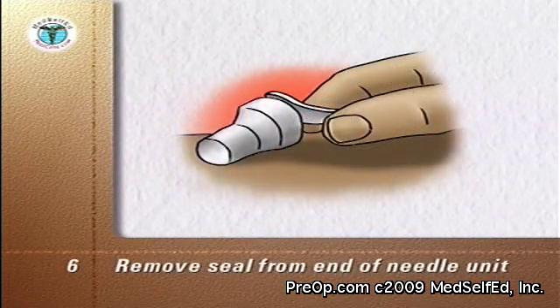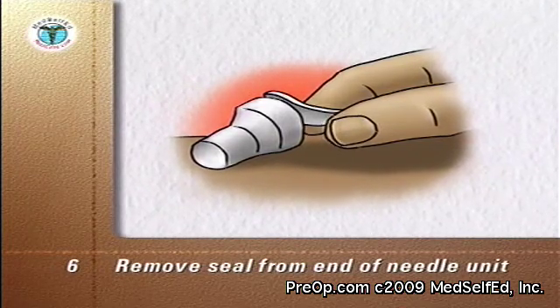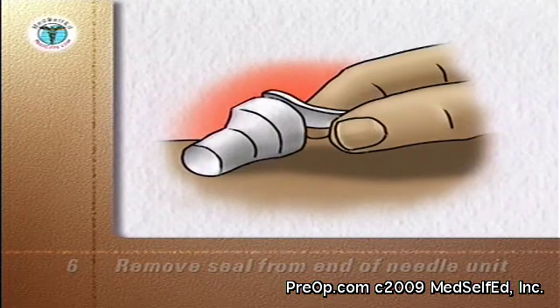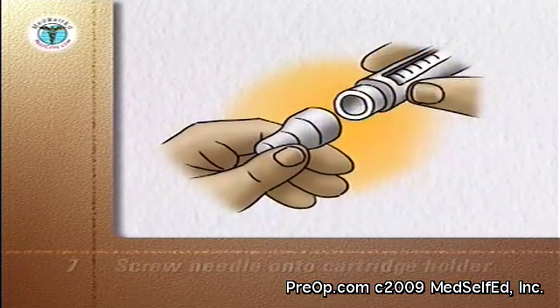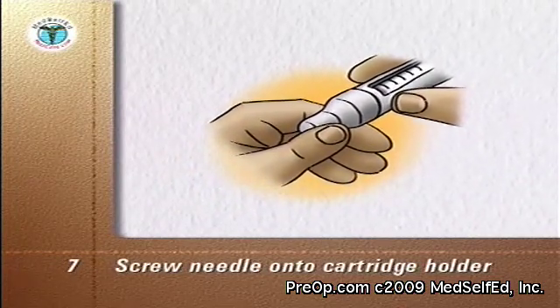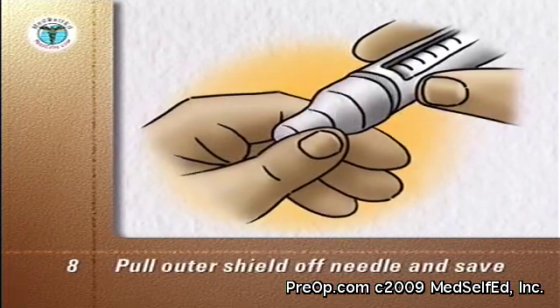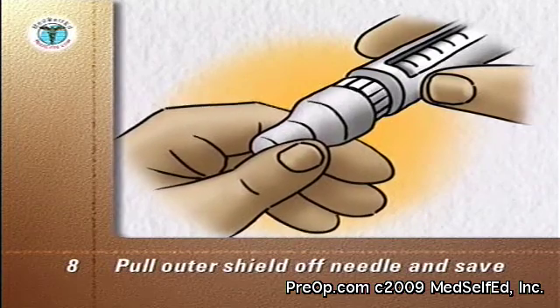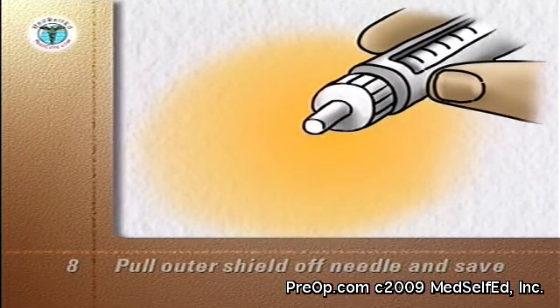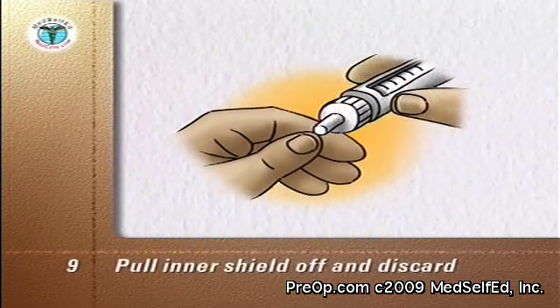Remove the seal from the end of the new needle unit. Don't touch the exposed needle or allow it to touch any other object. Screw the needle unit onto the end of the cartridge holder. Pull the outer shield off the needle — do not throw it away, as you will need it later to remove the needle unit from the pen. Pull the inner shield off the needle and discard it.